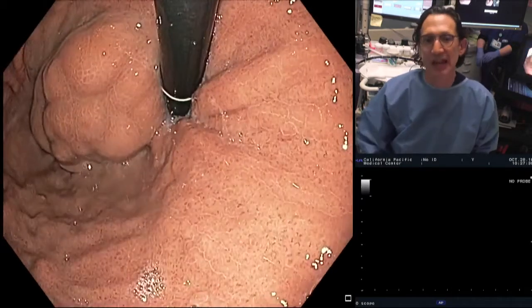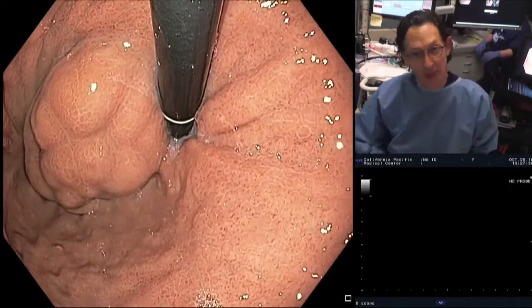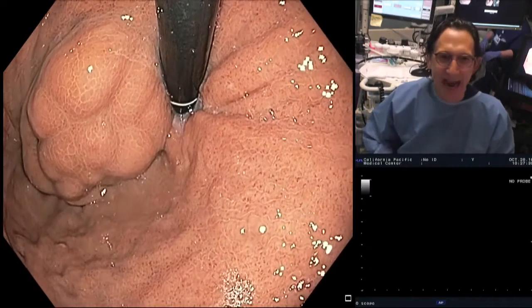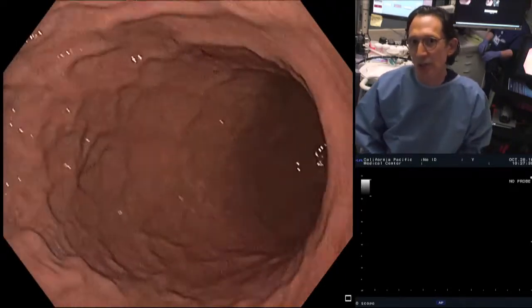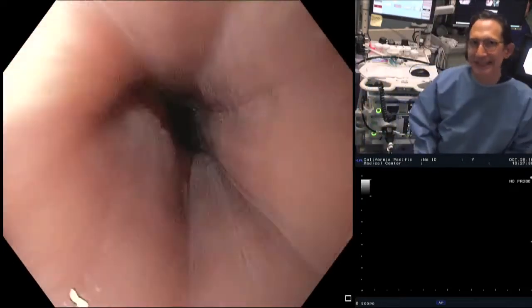And I really understand why your anesthesiologist is checking to make sure that he's paid the premiums for his liability insurance and so forth. But I think if we do it EUS-guided, and we're going to try to do this transesophageal rather than transgastric, I think we could actually accomplish this. But let's see. All right.